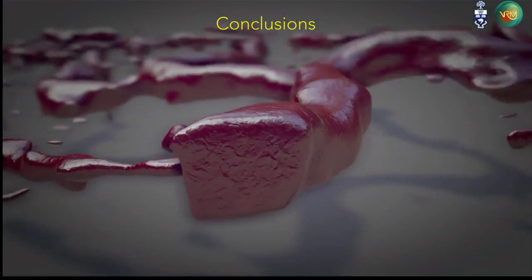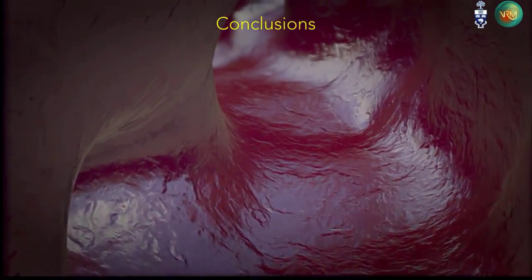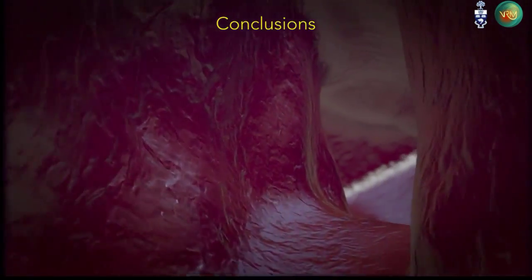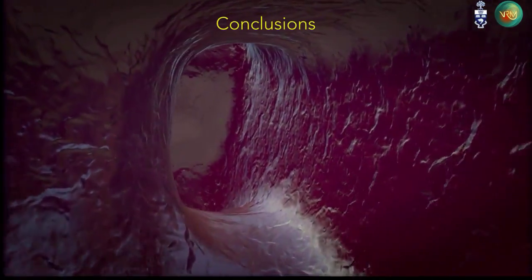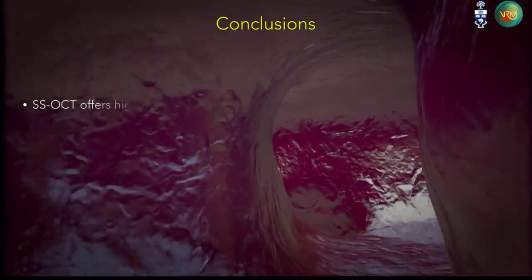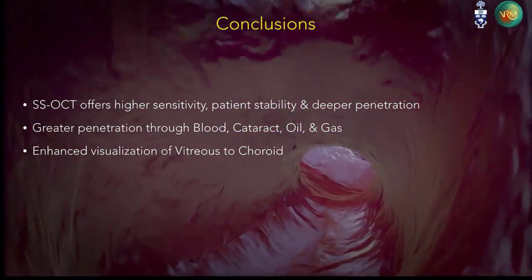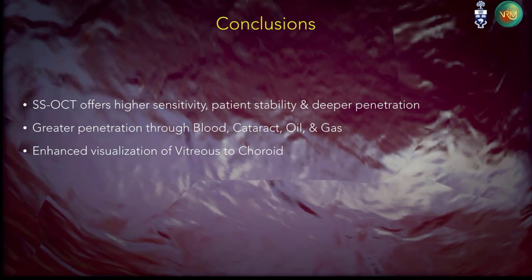So this just wraps it up. This shows another example of what we can do with these images. We've taken one of our OCT-A images and volume rendered it, and we're able to get in-depth vascular information about the degree of impairment of blood flow in these eyes by taking that same high volume data set and putting it into a volume rendered fashion. So this just reiterates everything we talked about, but it's a nice, cool fly-through that we are just stumbling upon how to use this information. We can see blood clots in this process and cholesterol plaques, etc.